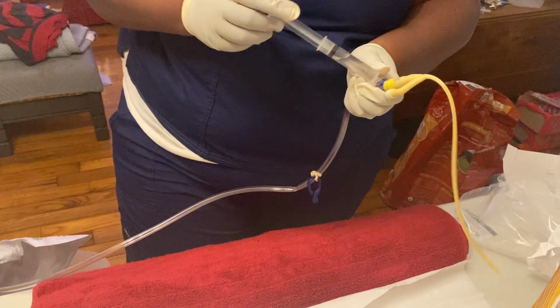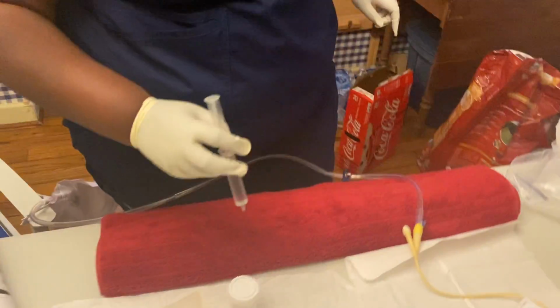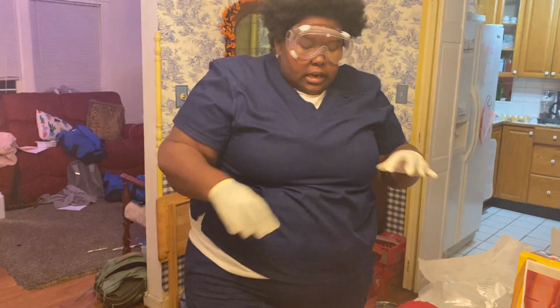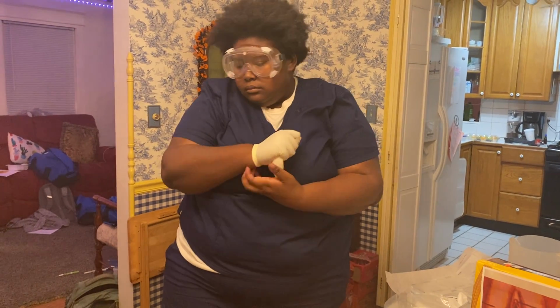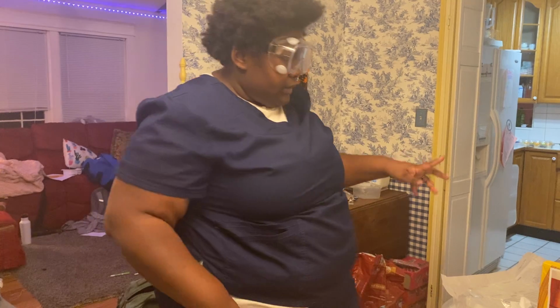From here, I would pull up till the urine comes out, and then I will put it in here without touching the rim of the cup. Next, I will put all of this up and then remove my gloves. Then I would document any color, consistency, odor, the amount, the location, the time, anything like that. And then I would get all my items up.